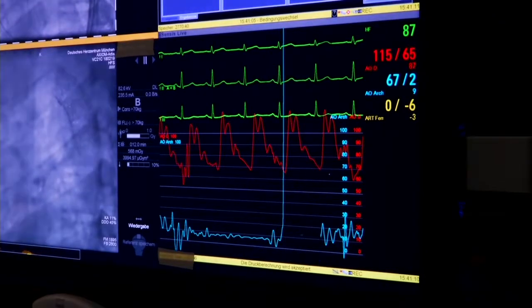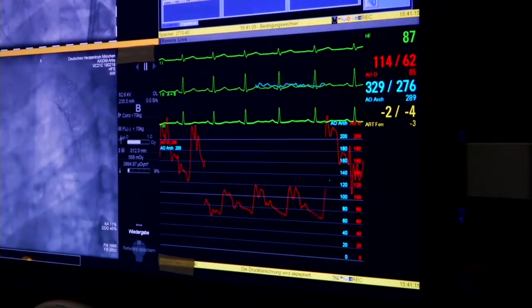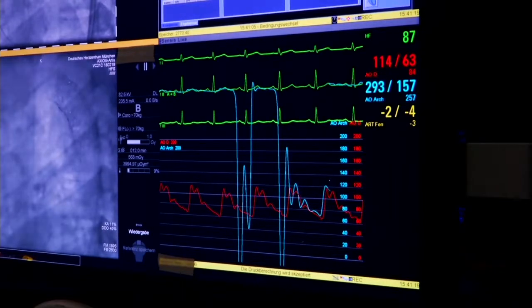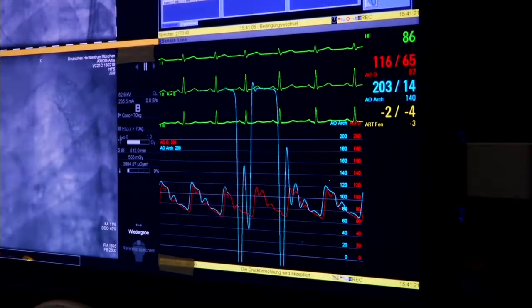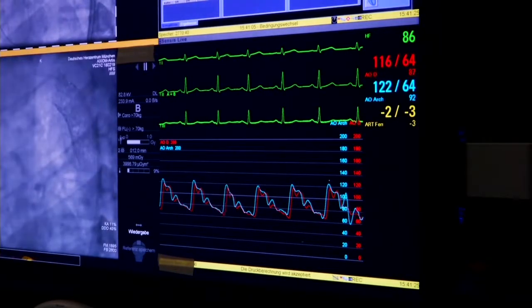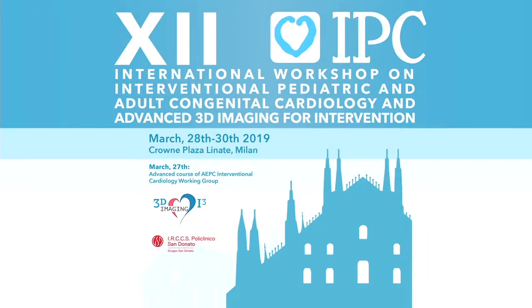At least the pressure is higher now. I think perhaps he has a little bit of pain. Okay. We can live with that. So this applause is for Jacques and colleagues who suggested to take the second stent.